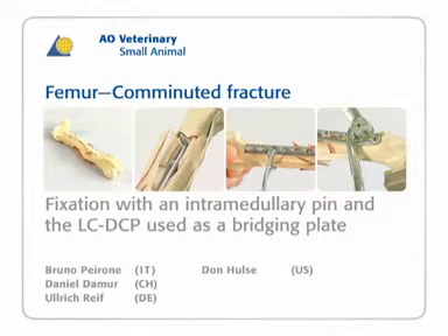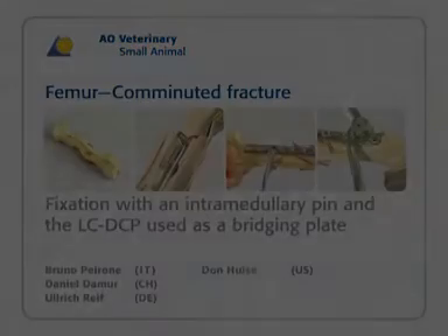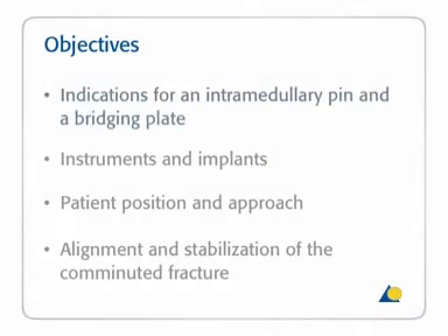In this presentation, a non-reducible comminuted fracture of the femur will be stabilized with an intramedullary pin and a 12-hole 3.5 LC-DCP used as a bridging plate. The objectives are to show the indications for the use of an intramedullary pin and a bridging plate, the instruments and implants needed, the patient position and approach, and the alignment and stabilization of the comminuted fracture.